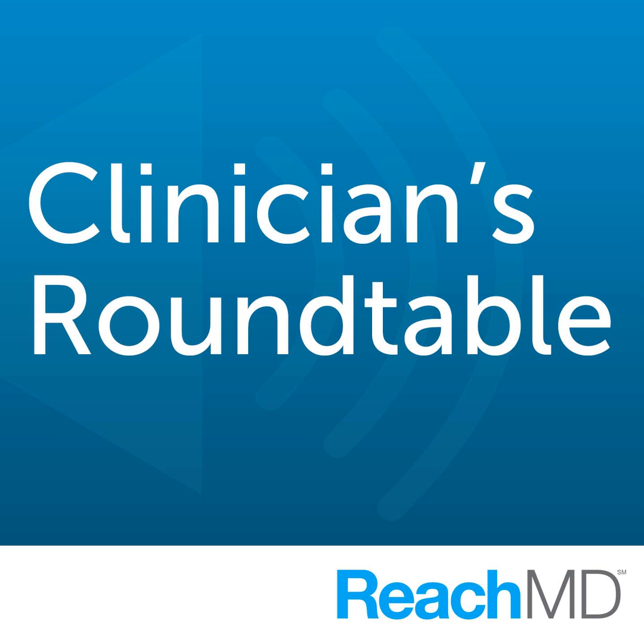So when we teach emergency physicians to use RSI, what we really stress is that they do a good difficult airway assessment, because the patients that are predicted to be very difficult to either intubate or to mask ventilate probably should not be paralyzed, because if at that point you can't get the endotracheal tube in and then they desat and you're unable to bag them up, you end up very quickly in a can't intubate, can't oxygenate scenario.